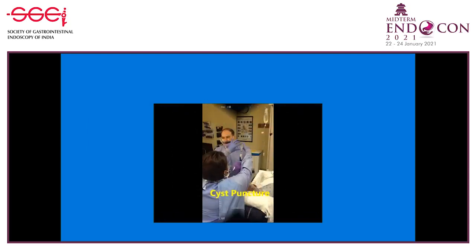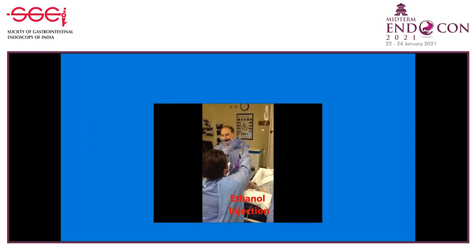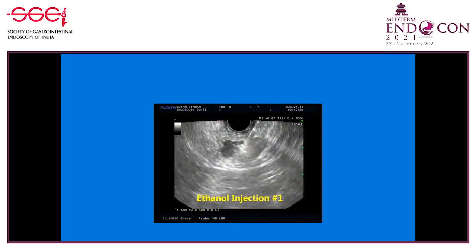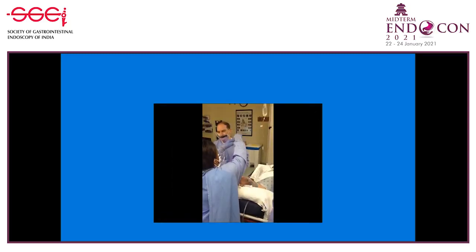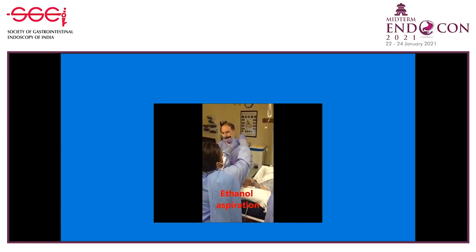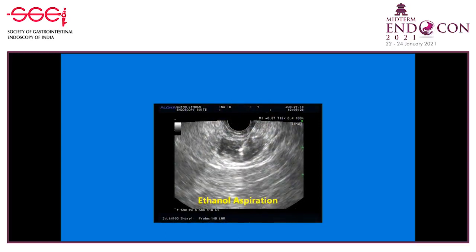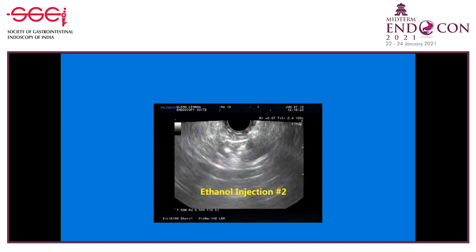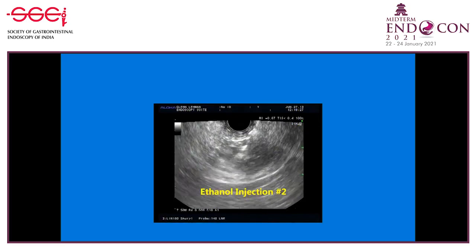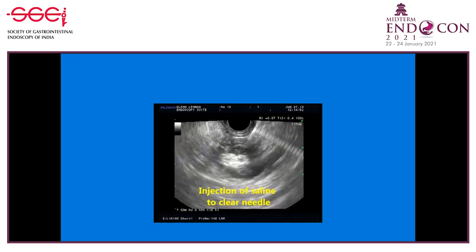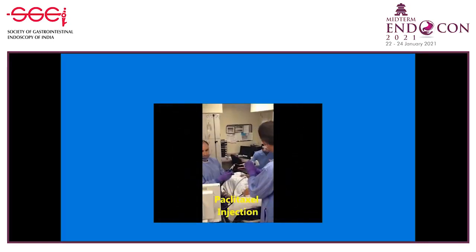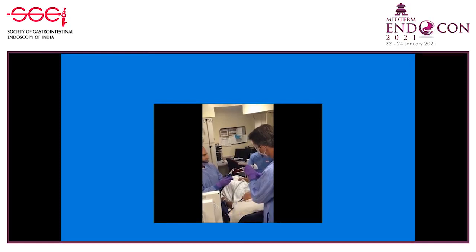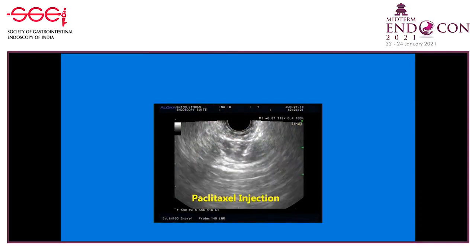For EUS-guided cyst ablation, initially there is cyst puncture. The initial lavage and aspiration can be performed with either saline or ethanol — in this procedure we are using ethanol as a lavage agent, typically performed over a three to five minute time frame. The initial injection is followed by aspiration, designed to expose the cyst epithelium to the agent. If ethanol is used it may have toxic effects; if saline is used it may destroy cells mechanically. Sometimes you can get rapid denaturation and debris. Once that is finished, chemotherapy is injected — this is me injecting paclitaxel into the cyst — and we leave this in place and do not re-aspirate the chemotherapy.